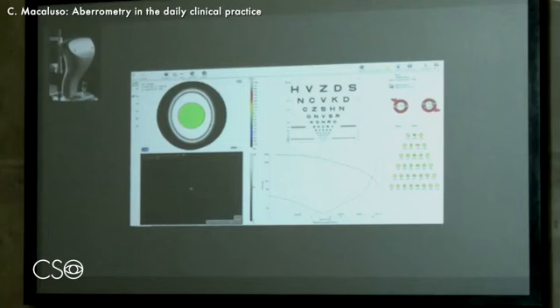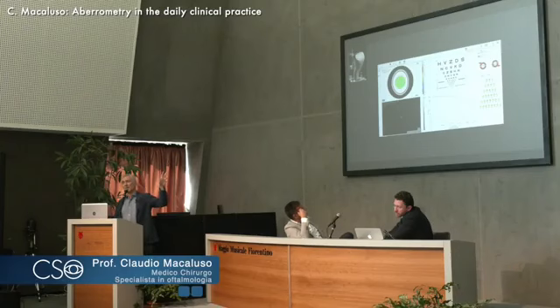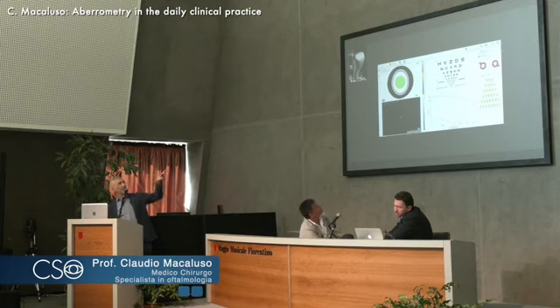That is using lenses. You see on the right, there is a cylinder and sphere, and we can play with those and manipulate them. And actually, if you click the BCVA, Best Corrected Visual Acuity button, the software is going to do the work for you.